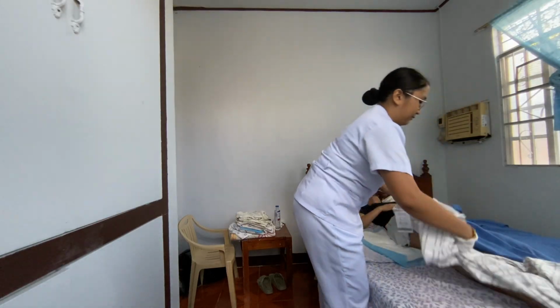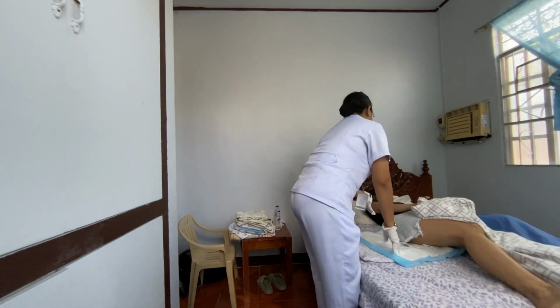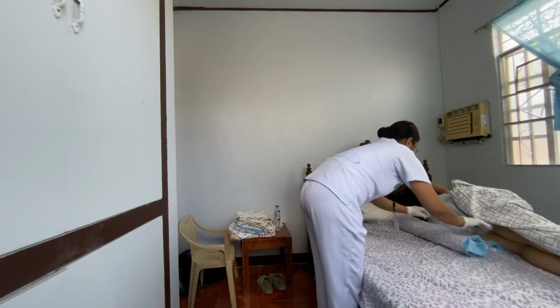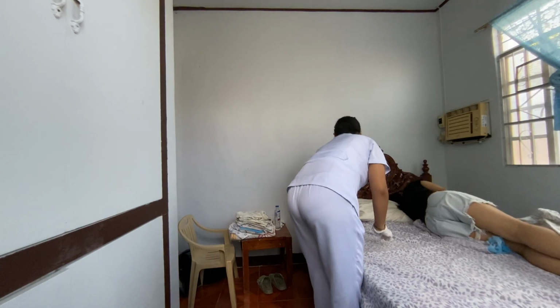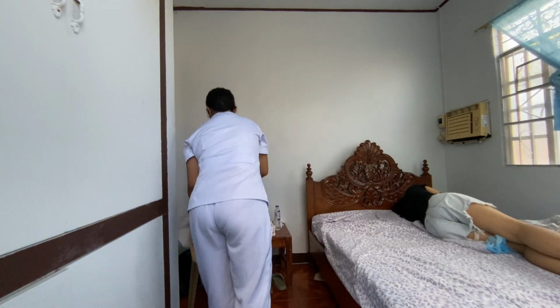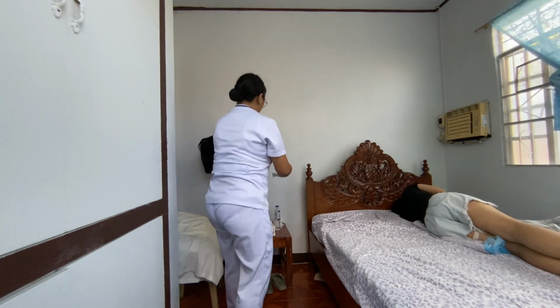I'm going to use in this scenario a garbage bag, in which I did not place the soiled linen on the floor and I did not hold soiled linens against my uniform to maintain hygiene. I have also assisted the patient to turn toward the opposite side of the bed and reposition the pillow under the patient's head. This allows the bed to be made on the vacant side.